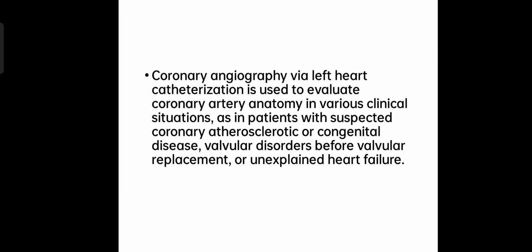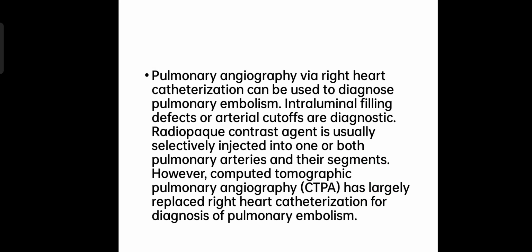Coronary angiography via left heart catheterization is used to evaluate coronary artery anatomy in various clinical situations, as in patients with suspected coronary atherosclerotic or congenital disease, valvular disorder before valvular replacement, or unexplained heart failure.